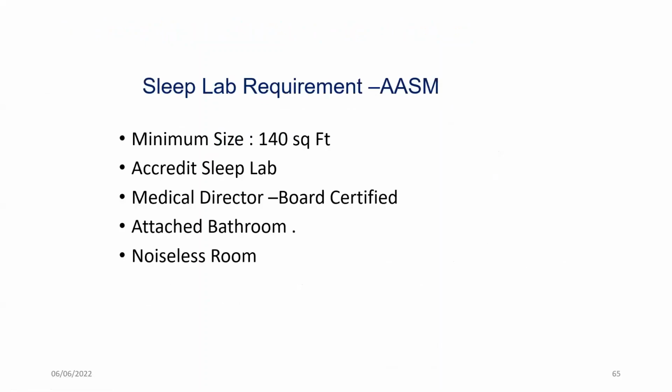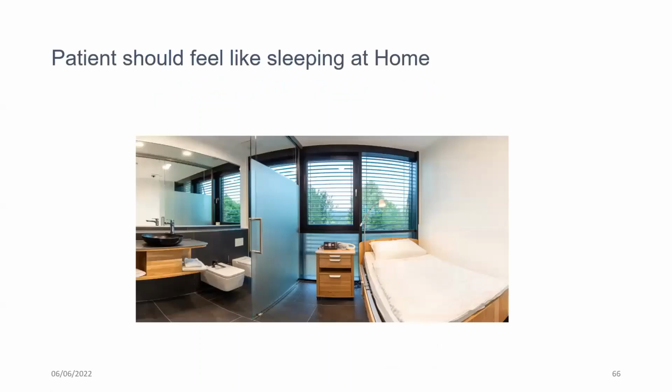Sleep lab requirement is basically, you have to have a room of 140 square feet size. You have to have an accredited sleep lab. The medical director has to be board certified. You have to have an attached bathroom, and you have to have a noiseless room, which AASM recommends. And this is a kind of ideal sleep lab. Patient should feel like sleeping at home.